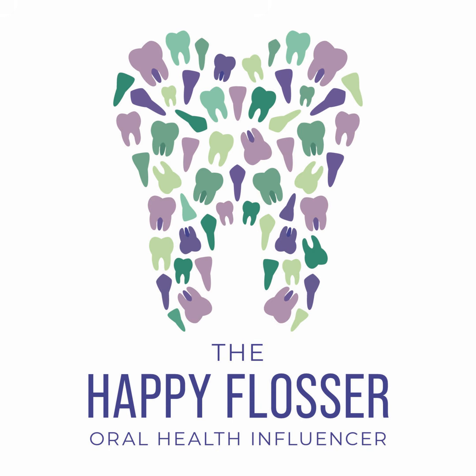When the target to the receptor distance is doubled, the original exposure time should be multiplied by 4. So it's important for you to know the size of the PID that you are using when you are taking an image on a patient. When the target to receptor distance is halved, the original exposure time should be divided by 4. So the opposite is true. It's really good for you to know this.